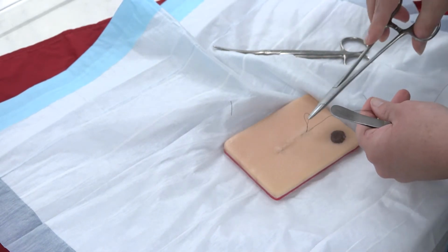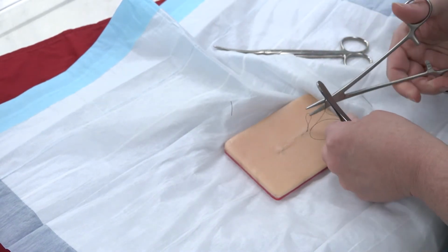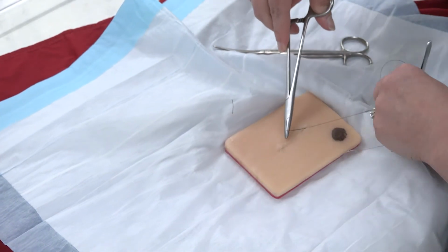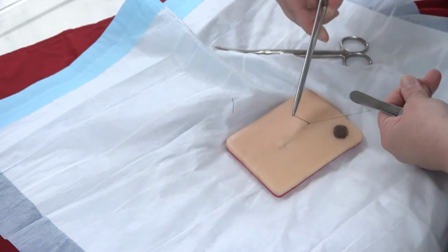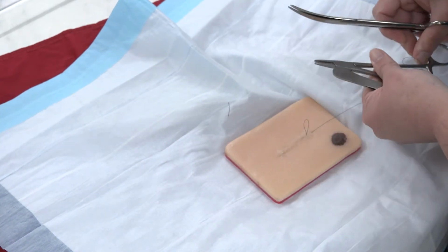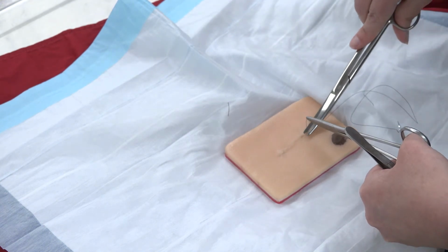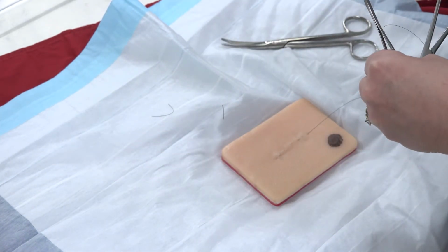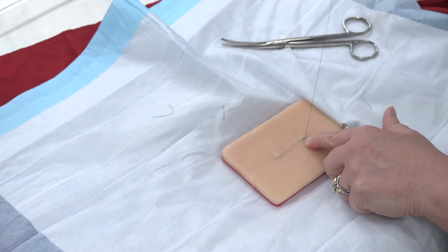All right? Now I could have gone either way. I could have taken the needle onto the other side. They just need to be on the same side. All right. So now it's just a normal tie. Now you can see it already wants to stay deep, right? But I am going to snip that loop. I left my tags just a little bit long so you could still see them sticking out of there. See right there.